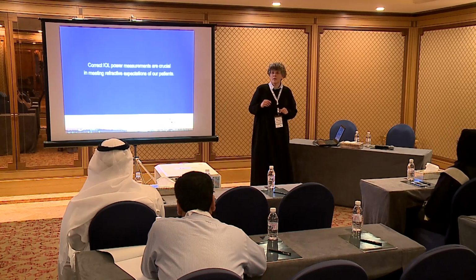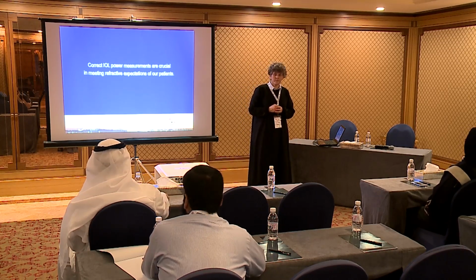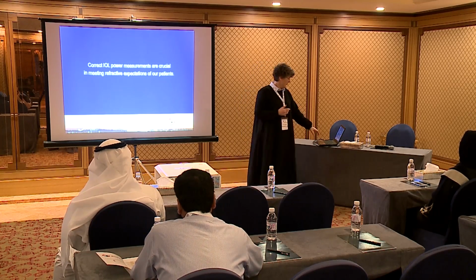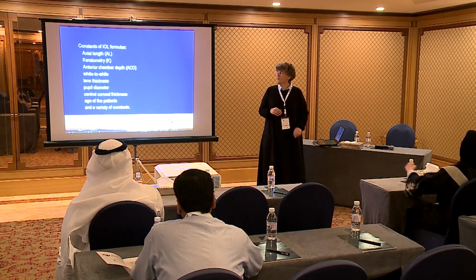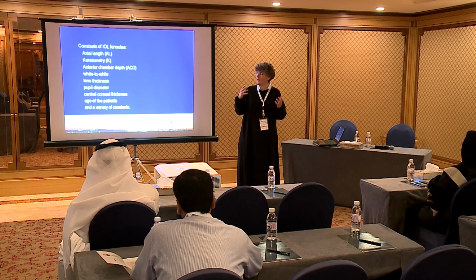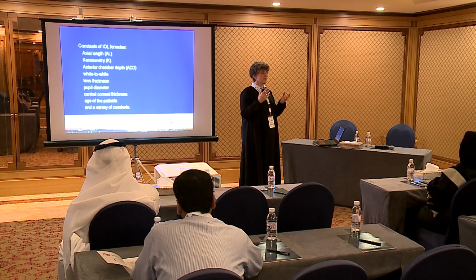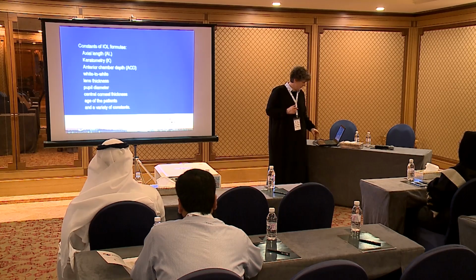So, when we do cataract surgery, it's crucial to get the correct IOL into the eye, because our patients are expecting more and more. And I'm sure it's the same in Europe and in the Middle East. Now, when we have all those formulas, we get bashed around the head with all the constants: the axial length we can't do without, the keratometry, the ACD, the white to white, the lens thickness, the central corneal thickness, anything goes, basically.